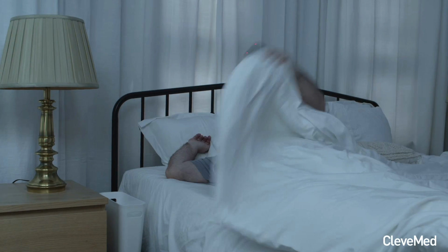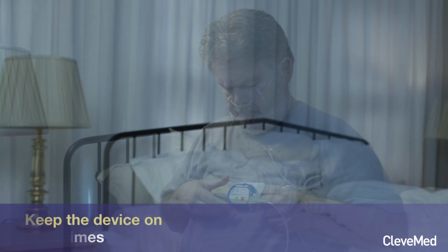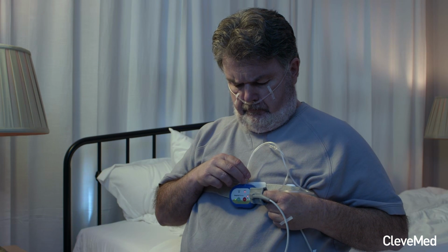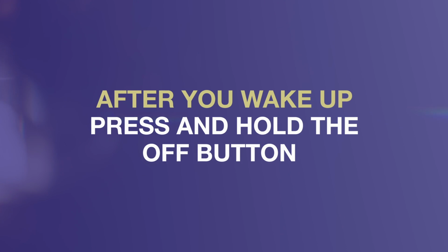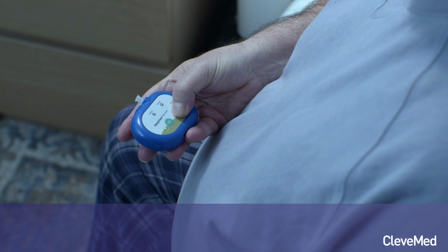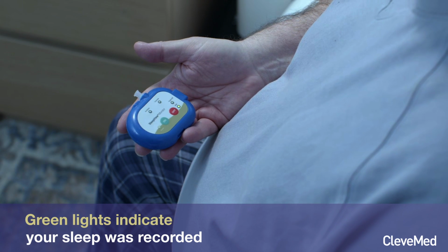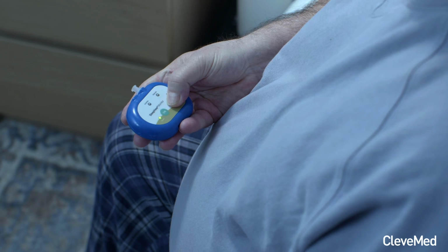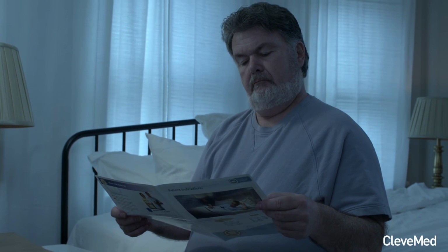Remember not to remove any sensors or turn the device off during the test, including if you need to use the bathroom. If any sensors fall off, simply put them back in place. After you wake up, press and hold the Off button on the SleepView Monitor for 3 seconds. If the lights circle clockwise in green, your sleep data was successfully recorded. If the lights on the device move counterclockwise in red, please review the tips on the instruction sheet for assistance.